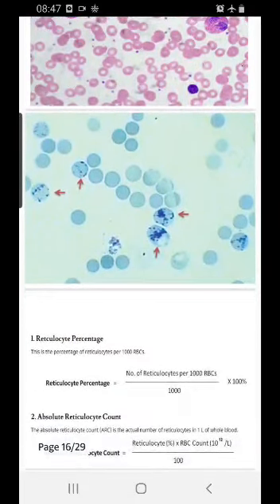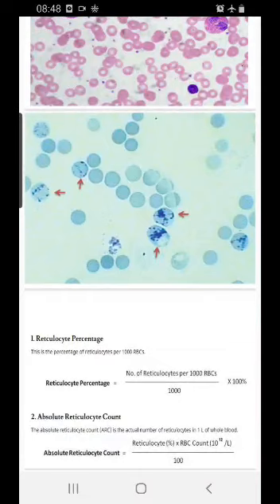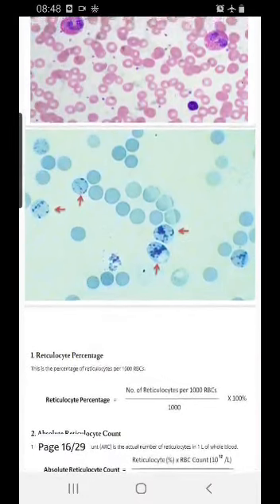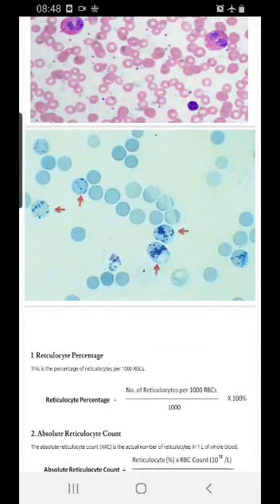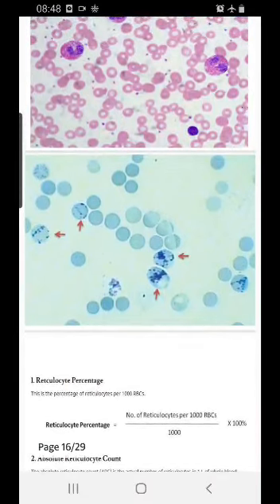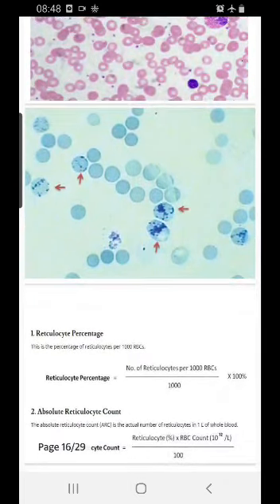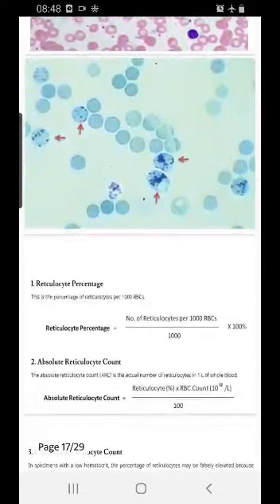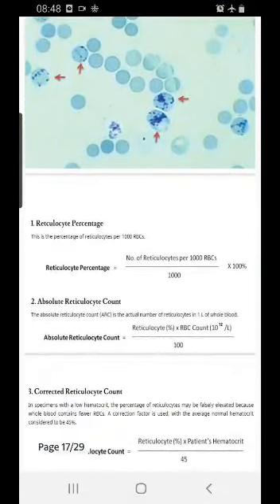Reticulocytes are immature RBCs in circulation — products of nucleated RBCs. The stain used is a supra-vital stain, toluidine blue. The dark blue crystals in the cytoplasm are RNA, because the cell is still immature and has not yet converted to a mature RBC. They stay in circulation for one to two days. Their presence indicates how much the bone marrow is producing RBCs — important in hemolytic anemias.